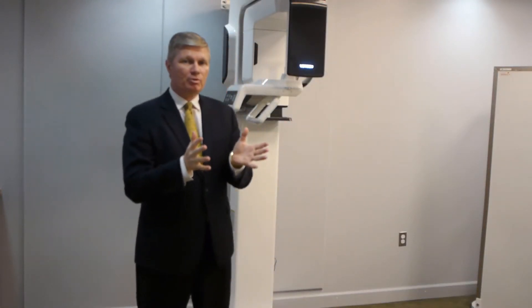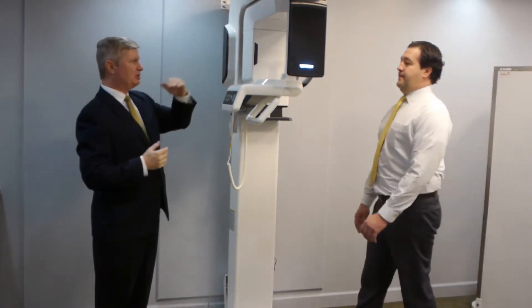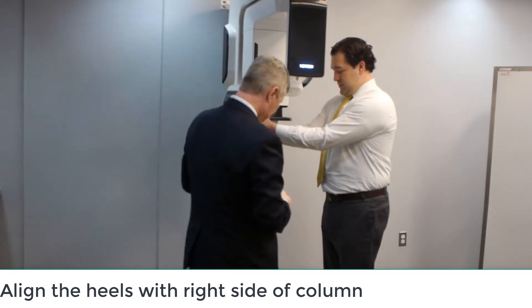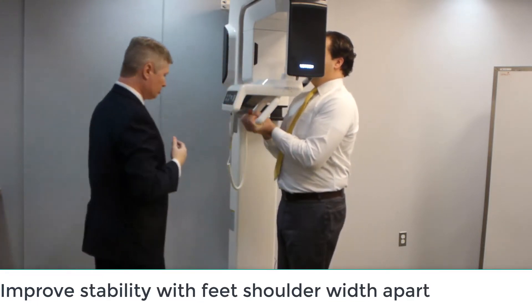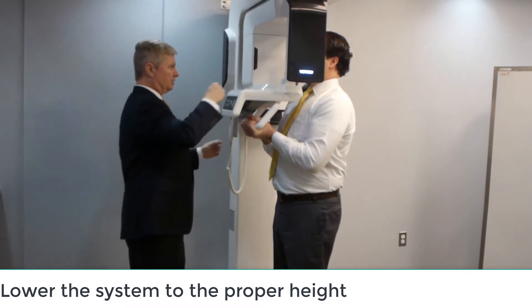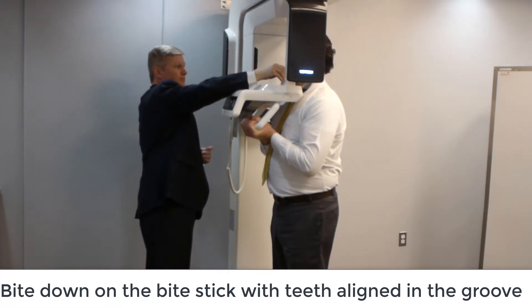In our first example, we're going to capture our panorama image with our smart imaging system. We'll have our patient come forward with the device set up a little bit higher. Place your hands in the bottom of the bar, palms facing towards the ceiling, and take your feet so they slide forward and line up with the right-hand side of the column, feet shoulder-width apart for stability. Bring the machine down a little bit, open your arch, put your chin on the chin rest, and bite down slowly with the teeth in the groove.